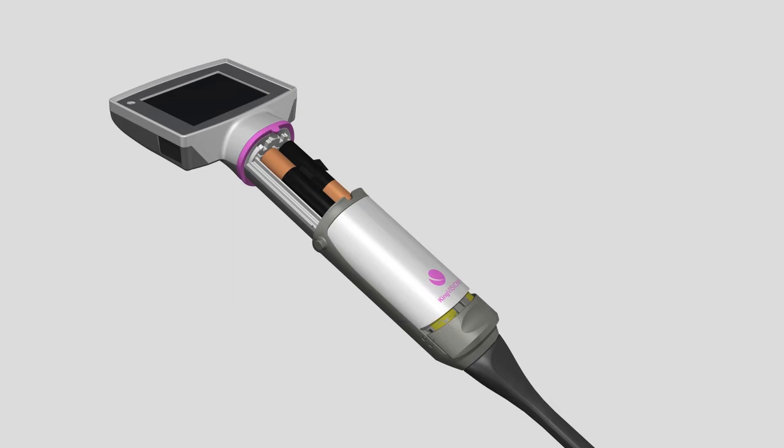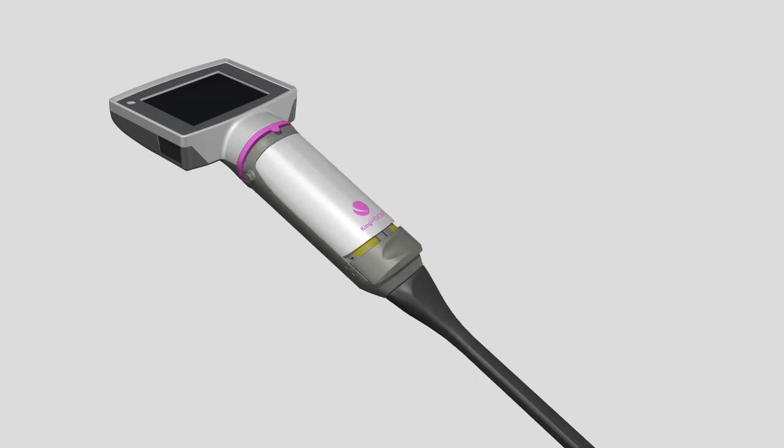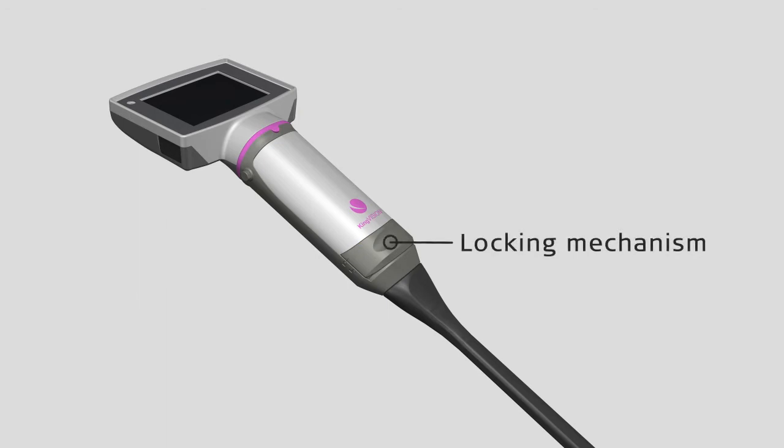Make sure the KingVision display is off before attaching the video adapter, otherwise the video image may become distorted or fill with static. Align the white side of the adapter to the matching side of the display and slide the adapter towards the video screen while pressing together firmly. Then slide the gray locking mechanism up until the yellow stripe is no longer visible. An audible click can be heard when the adapter is securely in place.